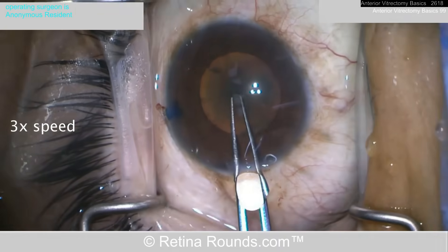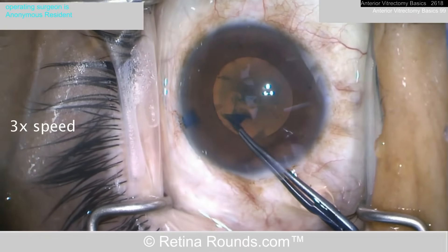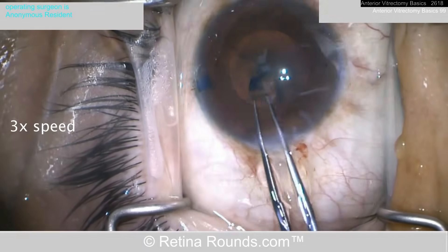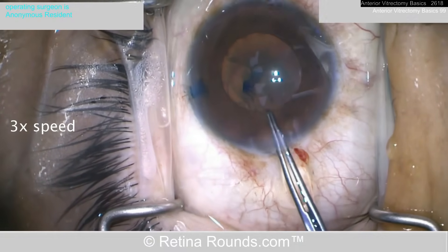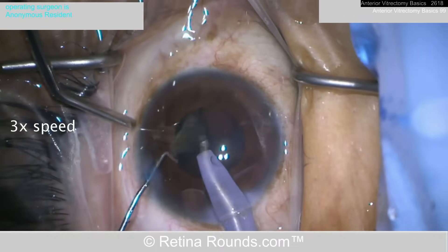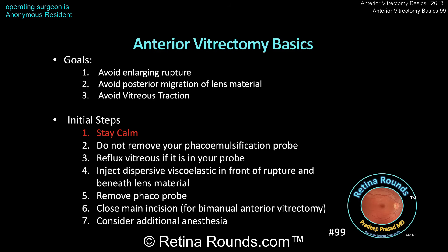This is a resident performing phacoemulsification on a relatively dense cataract. You can see Trypan Blue staining has been used to stain the capsule and a capsulorexis is initiated. As the capsulorexis is extended out into the subincisional space, it looks like that rexis runs out a little bit, but eventually it's continued by making a small nick and completing the 360. Now as the nuclear fragments are being removed, there's a very bright red reflex and the capsular bag appears to be violated posteriorly.